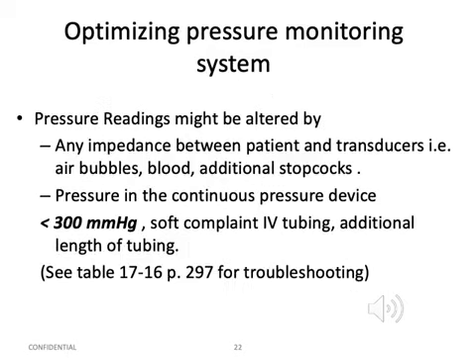هلا there are several technical or mechanical factors that could lead to inaccurate hemodynamic values. منها for example air bubbles، blood in the tube، ممكن يكون في clots. As we mentioned earlier, لازم يكون عنا system require continuous pressure of 300 mmHg حتى يمنع الباك فلو، تمام، and solution حتى to keep الكاثيتر patent.